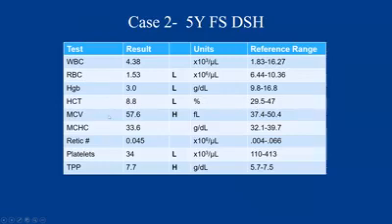This patient actually has an increase in its MCV, so that's its red cell size. And this increase in size in the absence of any regenerative response has been associated with feline leukemia infection in cats as a potential dysplastic or abnormal change. So that's kind of fitting with the history in this patient.